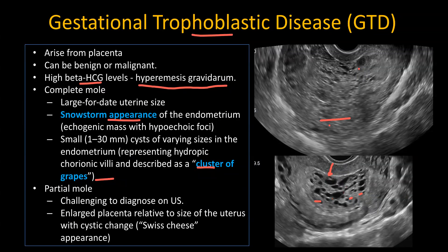A complete mole will show no fetal parts. Partial moles are difficult to diagnose on ultrasound. You may see an enlarged placenta relative to the uterus with cystic changes — known as a Swiss cheese appearance. It's very challenging, but if you see a gestational sac with adjacent cystic changes in the endometrium, you can consider this diagnosis.